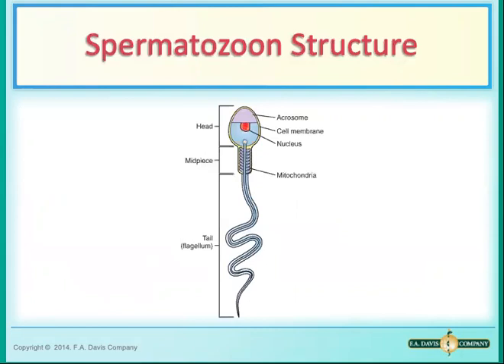So here is the typical morphology of it. You also have a picture of it in your book, figure 11.3, that is normal. So you'll see that the normal sperm has an oval-shaped head that is approximately 5 micrometers long and 3 micrometers wide, with a long flagellate tail, approximately 45 micrometers long.